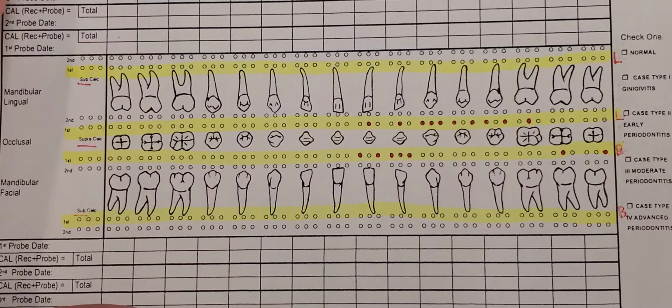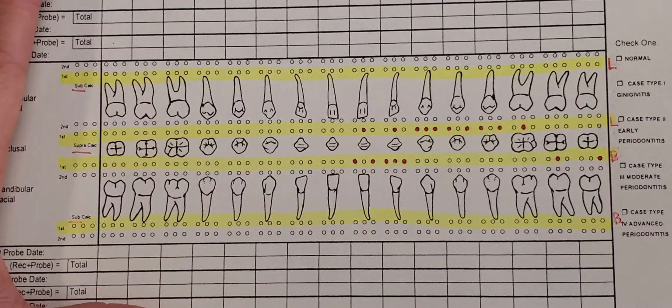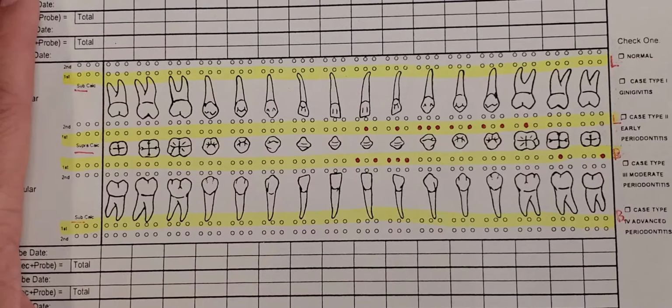Then, as you're exploring, you're going to be calling out subcalculus, and you're going to be deciding, is the calculus that you have grainy calculus or roughness, or is it definite calculus or spicules? If it's grainy or roughness, you fill in the dot. If it's definite or spicules, you'll put an X over the circle.